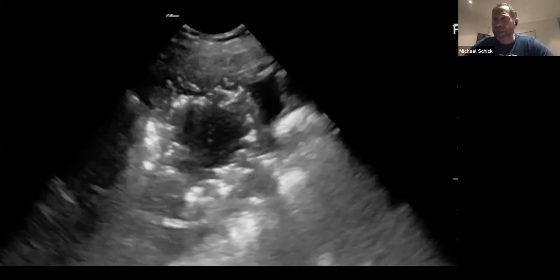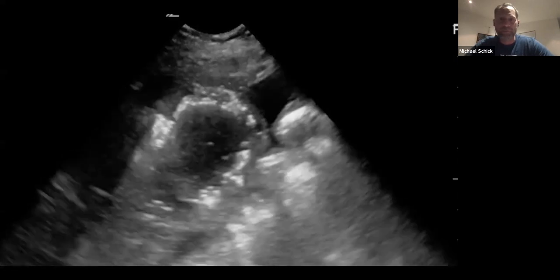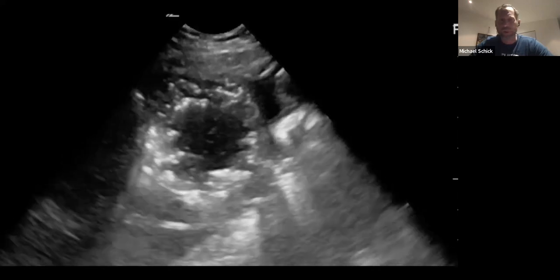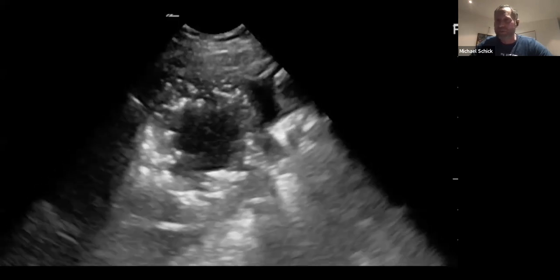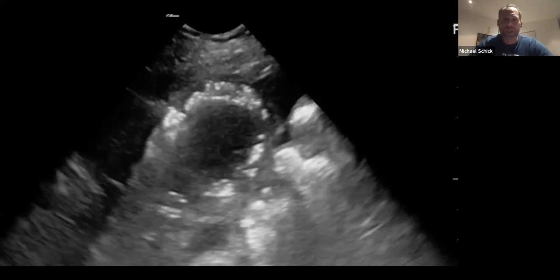So you do an ultrasound, and this is what you might see, the vomiting infant. All the risk factors are there. It's not supposed to be mysterious, right? It's a high risk infant. They're premature. We're in the NICU.